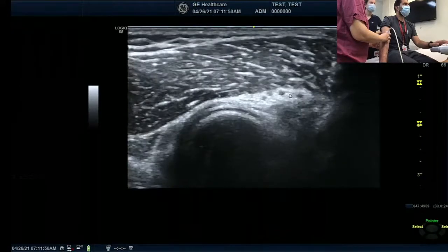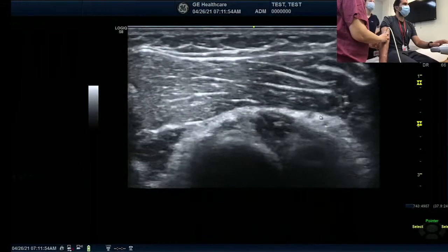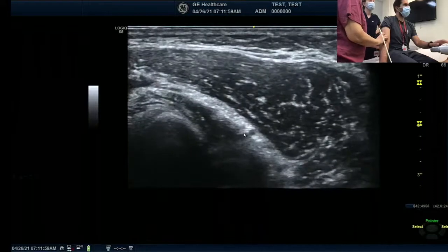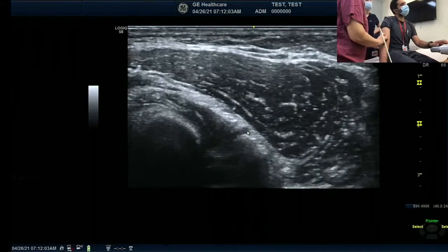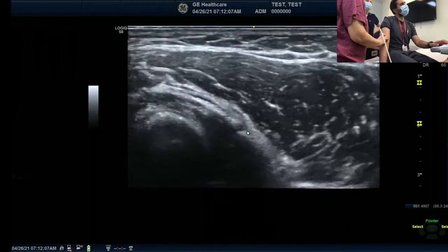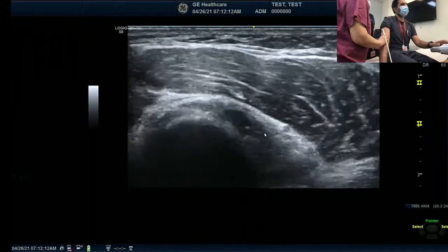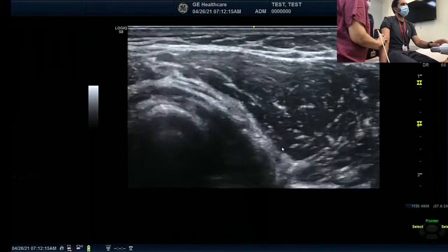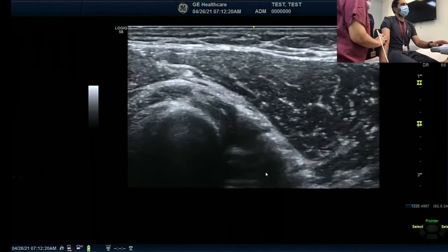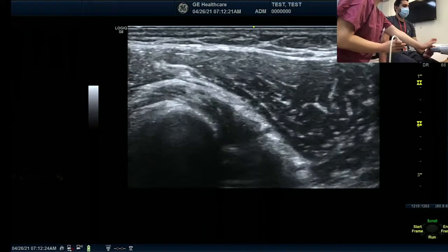Now we're going to go radial. Also, it's beautiful, that one. So I'm going to move posteriorly but distally. So still, this is the deep. We don't call it the deep branch yet, right? Because it has to go to the arcade of Frohse. That one, right? Okay. So look at this. It's going into the supinator. Here, can you freeze? Yeah, now you can move. Yeah, that one. So cursor.